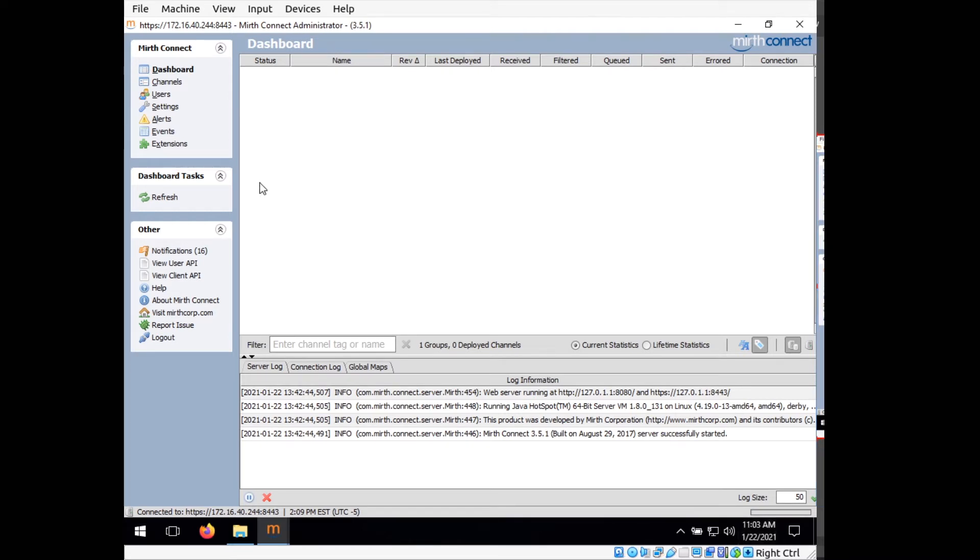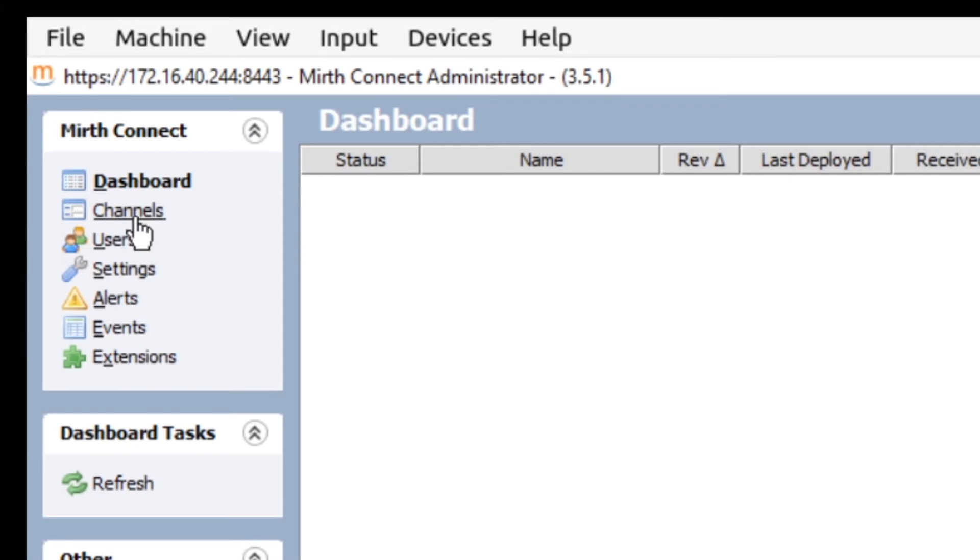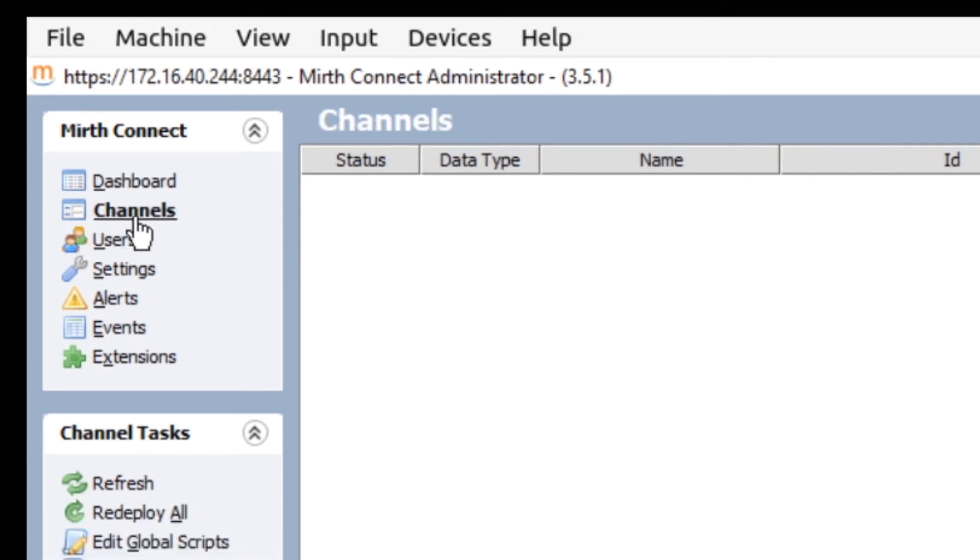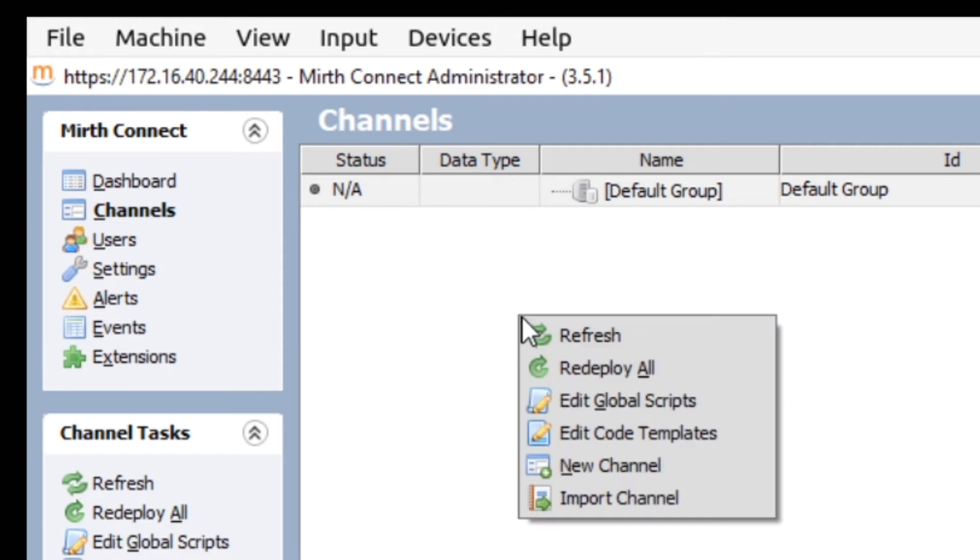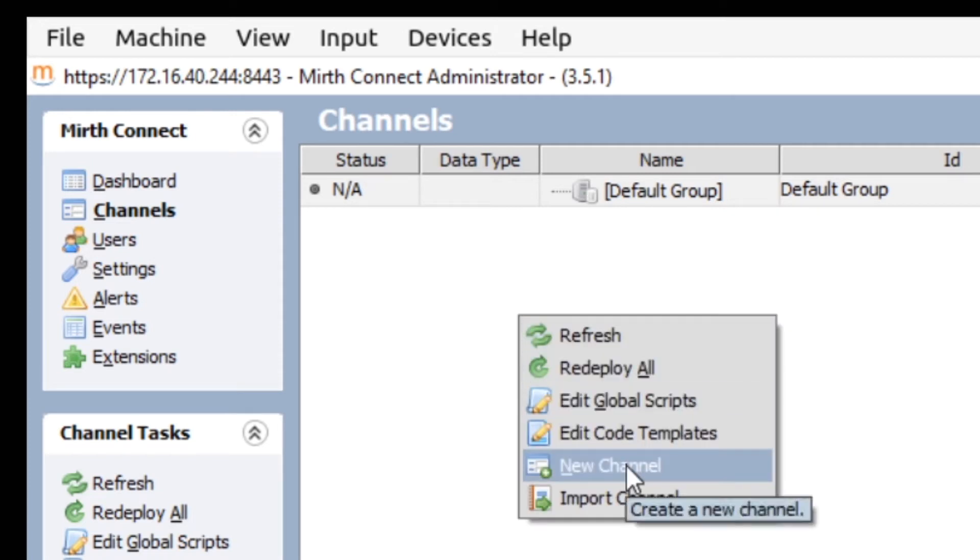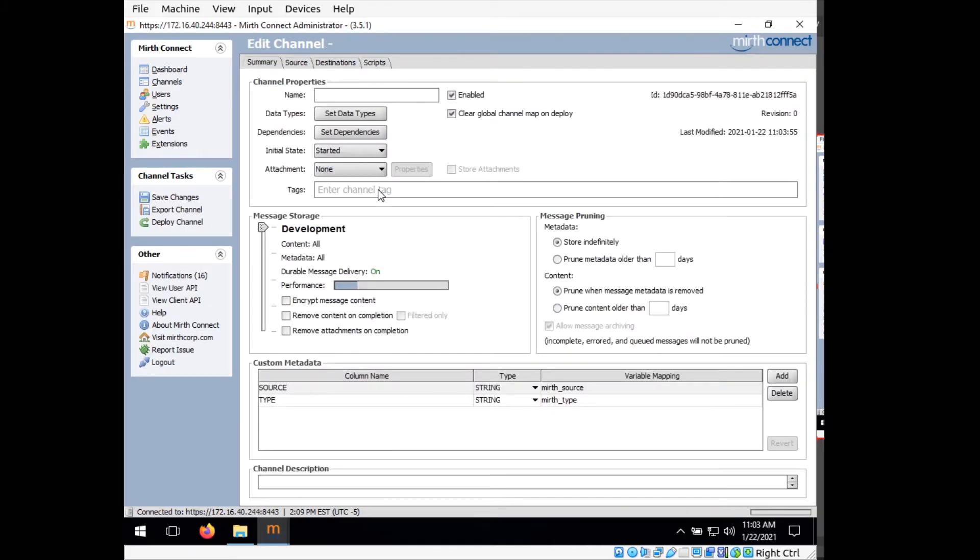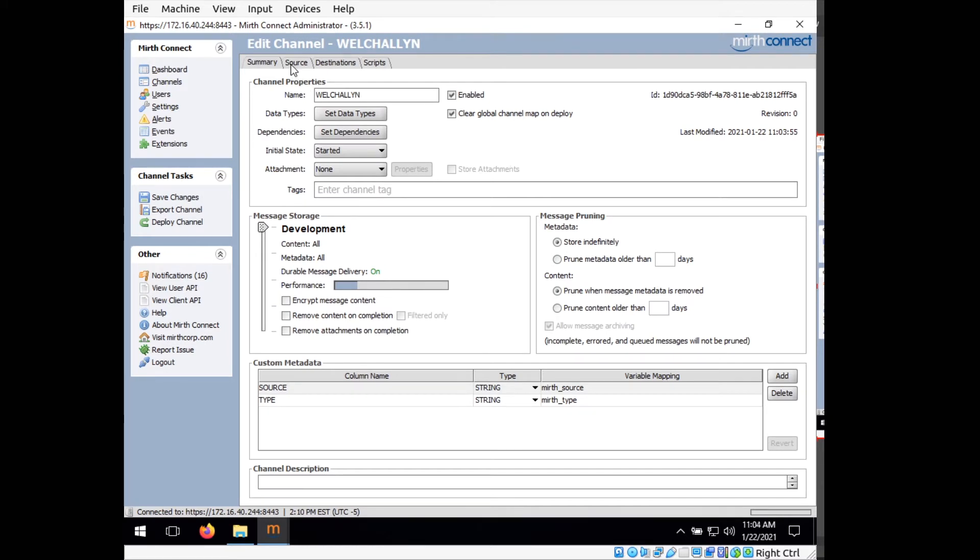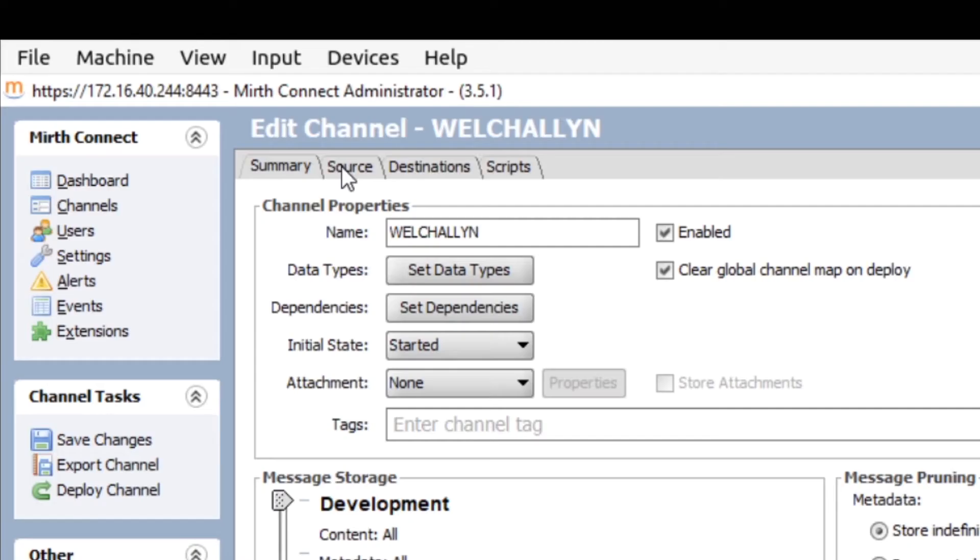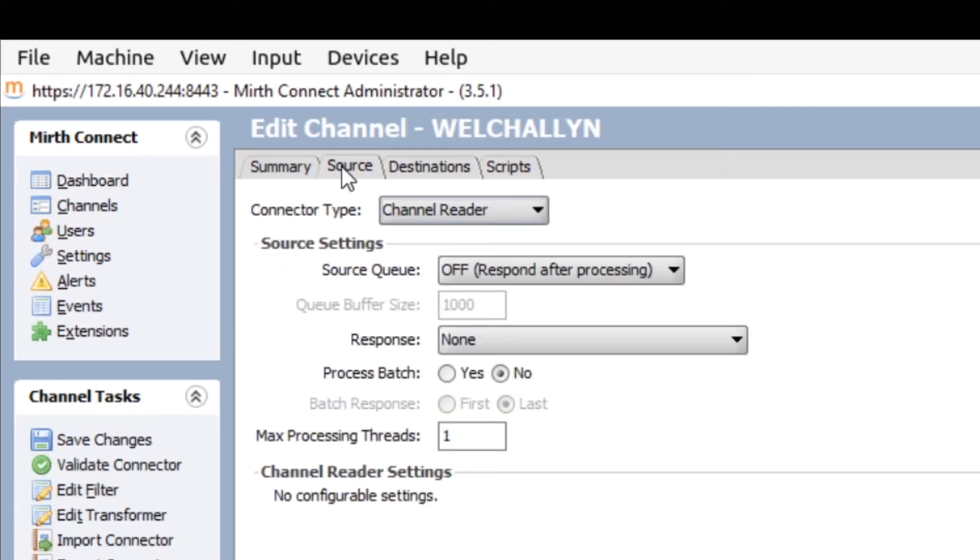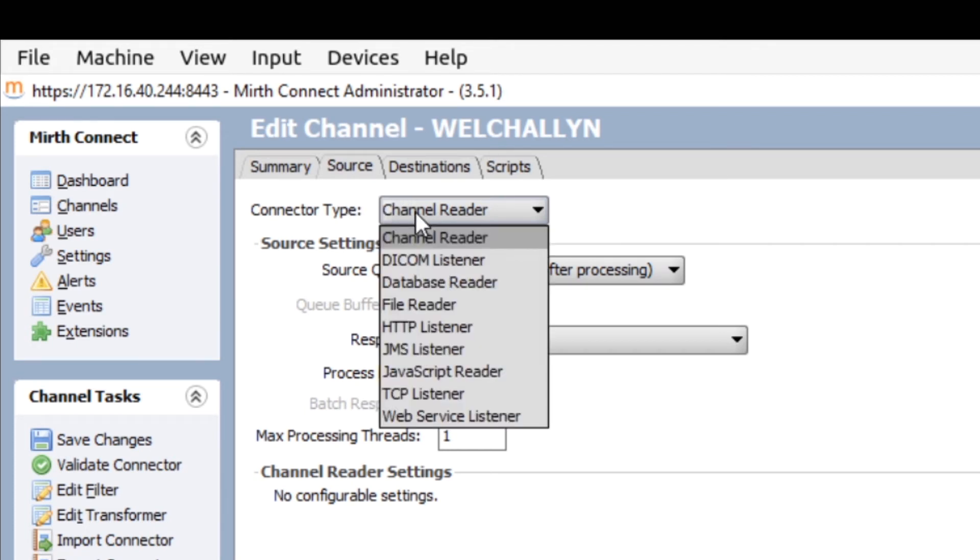So what we're going to do first is go up to channels and then right click in this area and select new channel. We're going to call this channel Welch Allyn. Under source, when we switch to this, we want to select connector type, change it from channel reader to TCP listener.